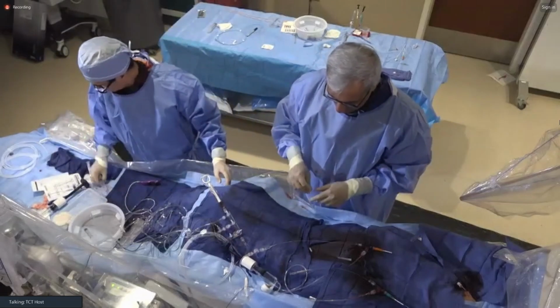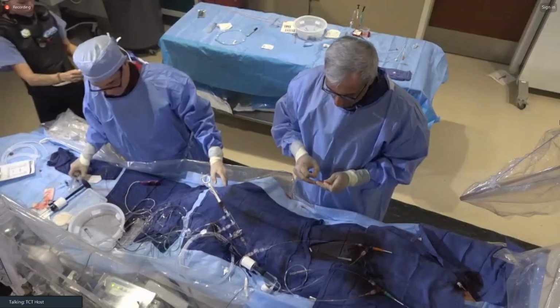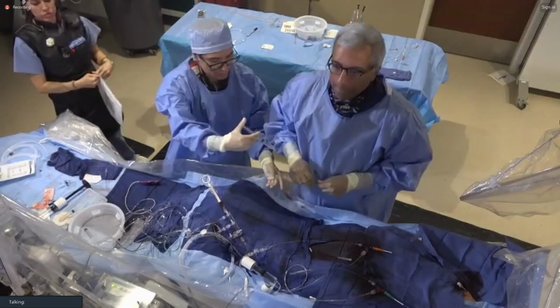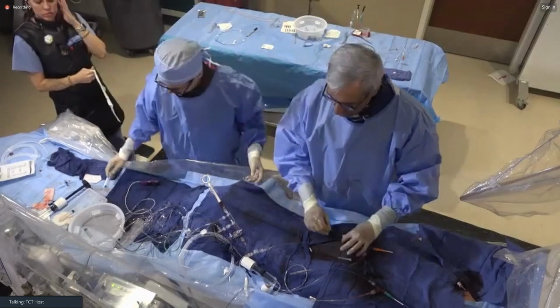It's only available in Gaia Next, maybe fourth generation, but it's not available in India. Yeah, we don't have that 10 gram tip load. We don't have that in North America either, right? And that's the point at which you go to a Hornet 14.